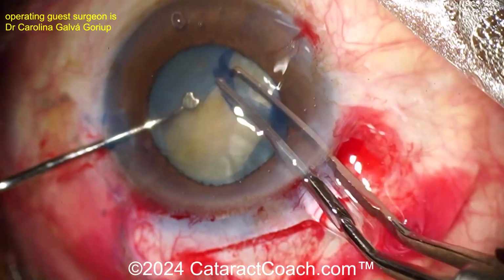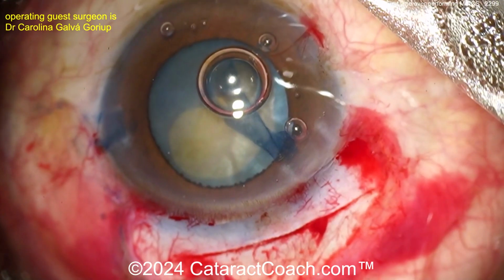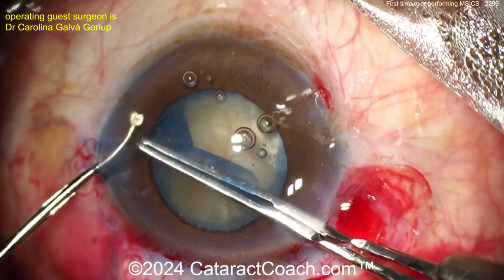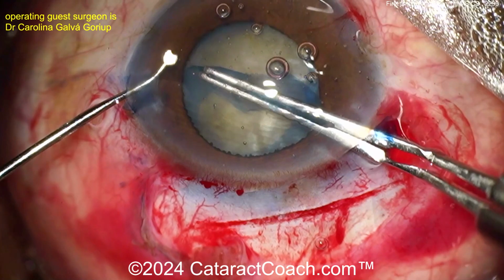And our surgeon here is doing a beautiful job. Nice, big, generous rhexis. I don't mind if it's not even overlapping the optic 360. Just get a big rhexis done. Because you got to get the whole nucleus up out of the bag. So here it is. Go, go, go, go, go. Look at that. Looks fantastic.